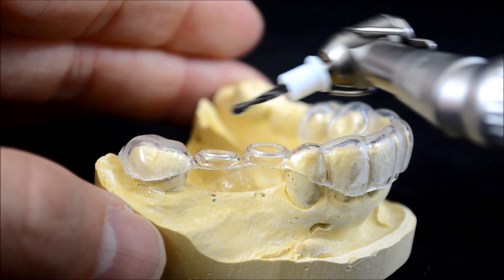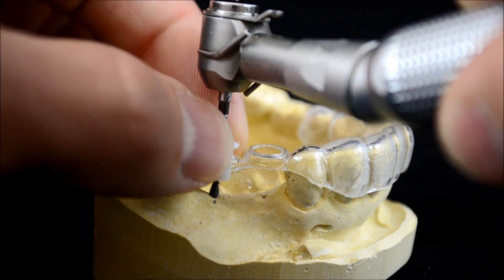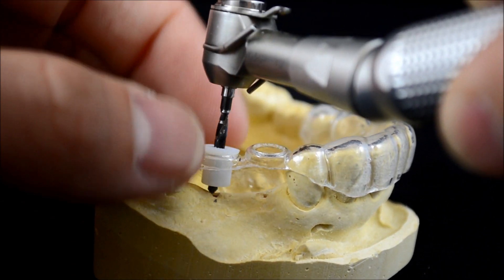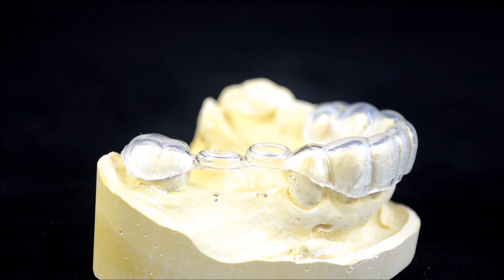Note that this provides full visibility to the site and requires the same vertical space as freehand drilling. Please visit GuidedSurgerySolutions.com for sample cases and additional information on our guides and protocols.